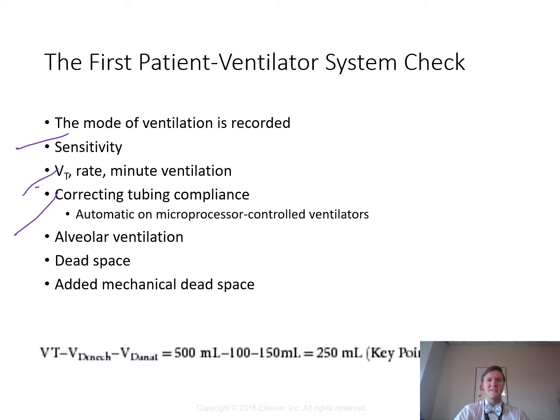But older ventilators, if you ever have to bring those out of retirement or into operation, you can get a set value for the tubing compliance, and we can always practice that as well. But you're looking at compensating for the volume loss due to tubing compliance.